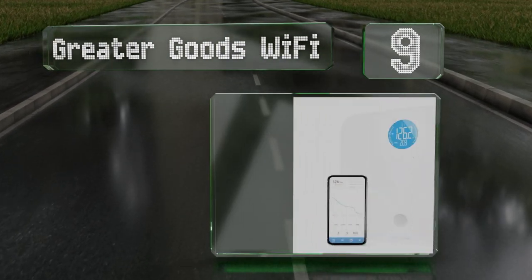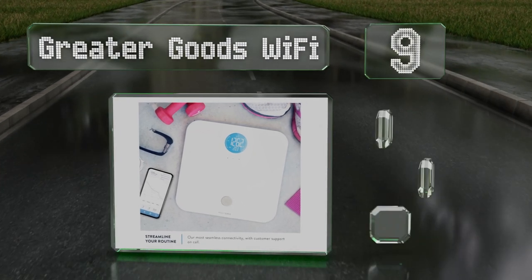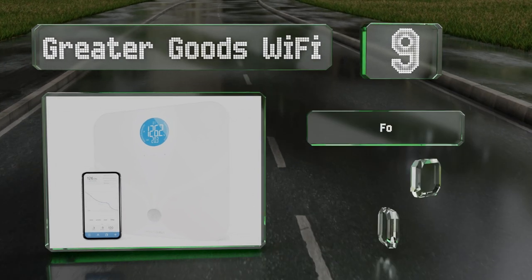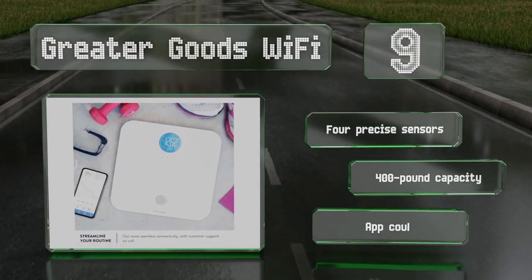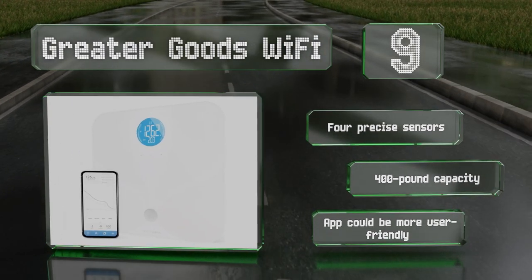At number nine, you can keep tabs on your ups and downs with the Greater Goods Wi-Fi, which conveniently shows your BMI on its screen. The rest of the information it gathers can be sent automatically to your favorite fitness platforms for hassle-free monitoring. It's equipped with four precise sensors and a 400-pound capacity, but the app could be more user-friendly.